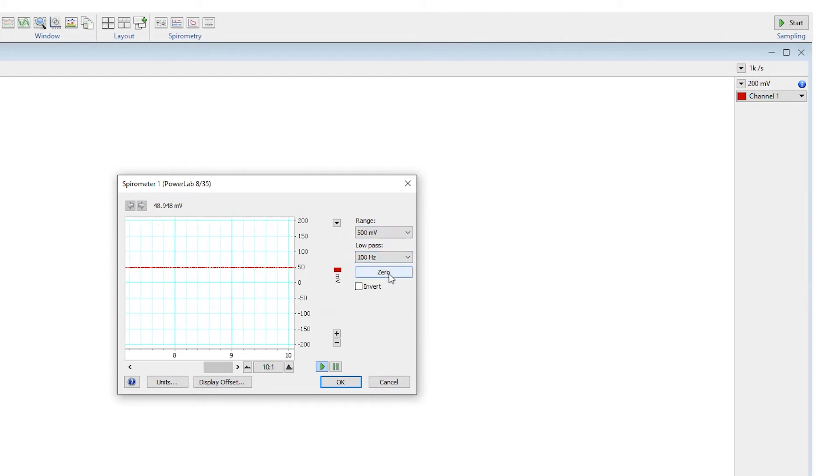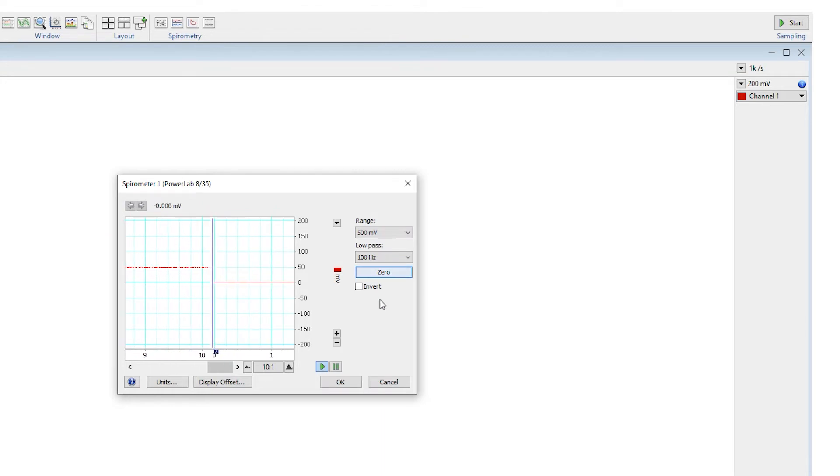Once the flow head is ready to be zeroed, the zero button can be clicked. Once zeroed, click OK.